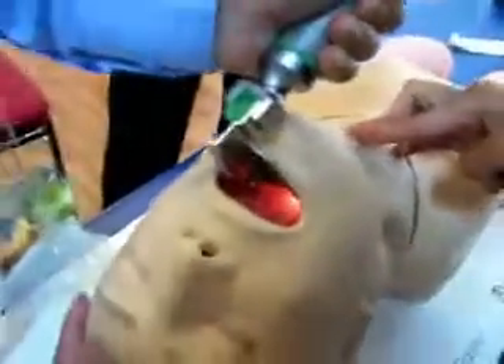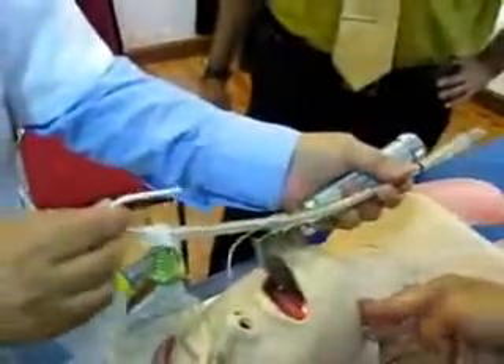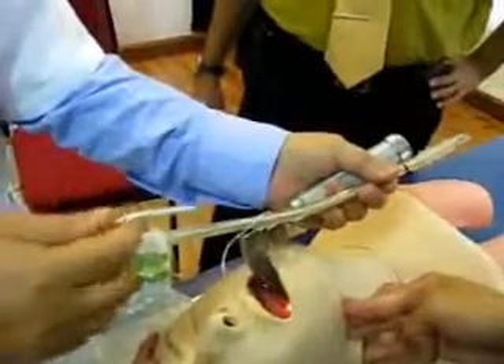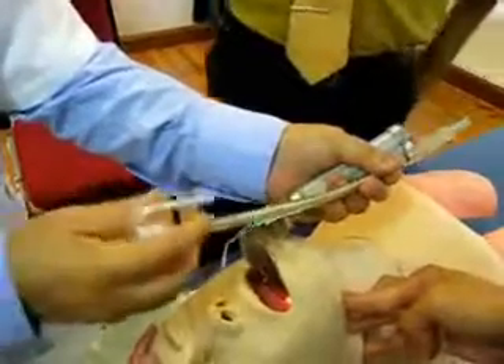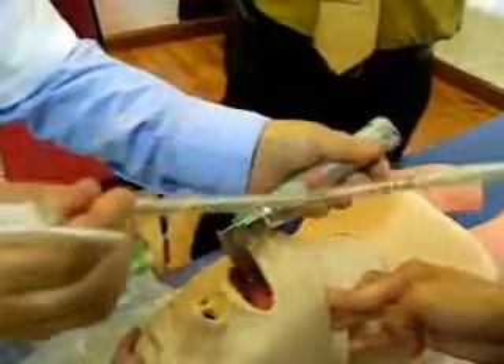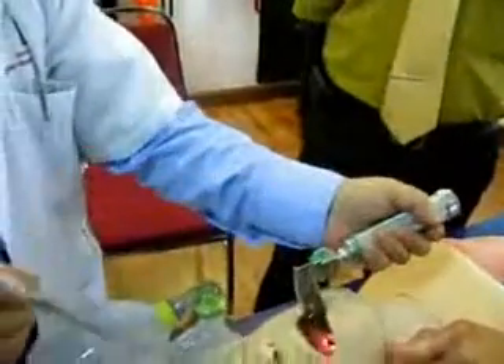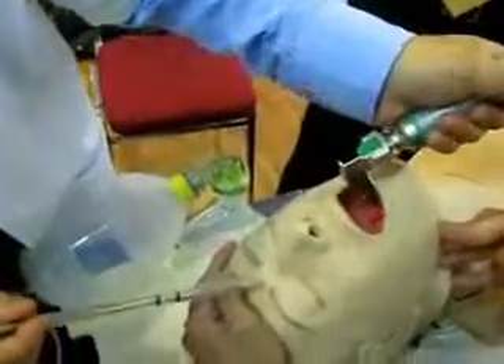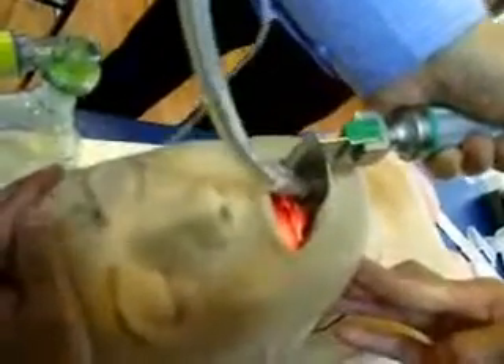The laryngeal opening is clearly seen. I will take the endotracheal tube. This is the stylet or bougie, which makes the endotracheal tube stiff so that it can easily be inserted into the laryngeal opening. You can bend the endotracheal tube to make it like a hockey stick.